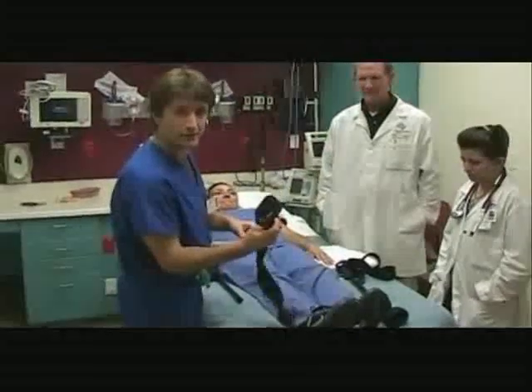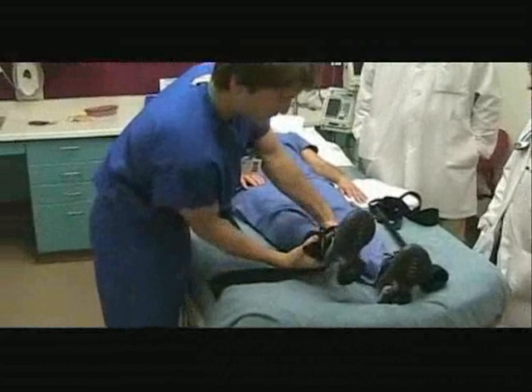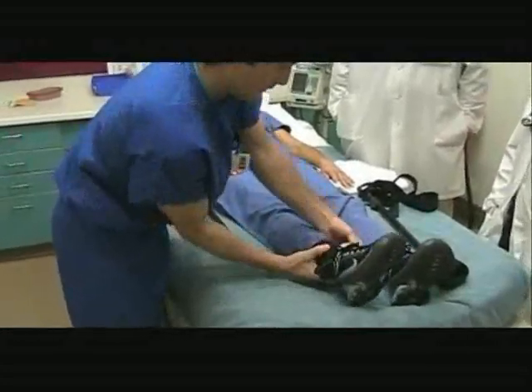Here's the ankle hitch. It attaches to the lower limb. It fits over small limbs and large ski boots.